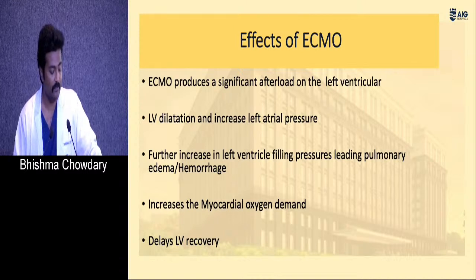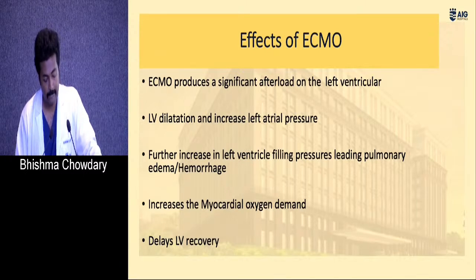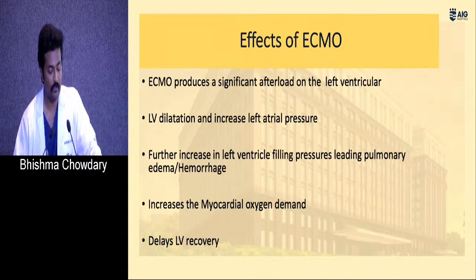There was a significant afterload on the left ventricle, causing the left ventricle to dilate and further elevating her wedge pressures, and pulmonary edema not subsiding. Even though the organs have been taken care of and the shock has been taken care of, the effects of ECMO started to show, even with the IABP.